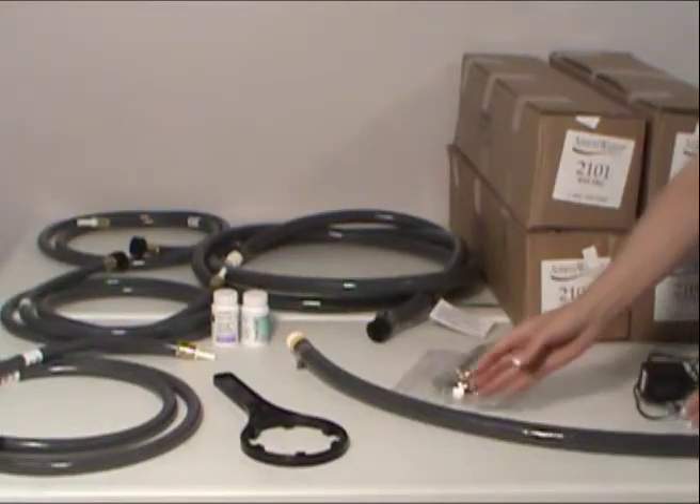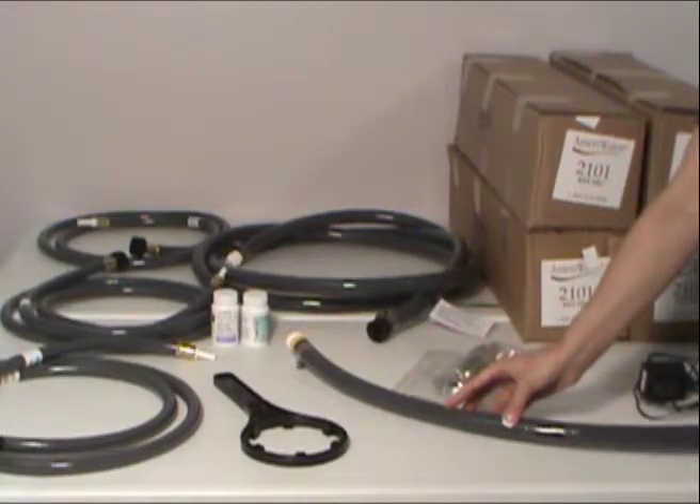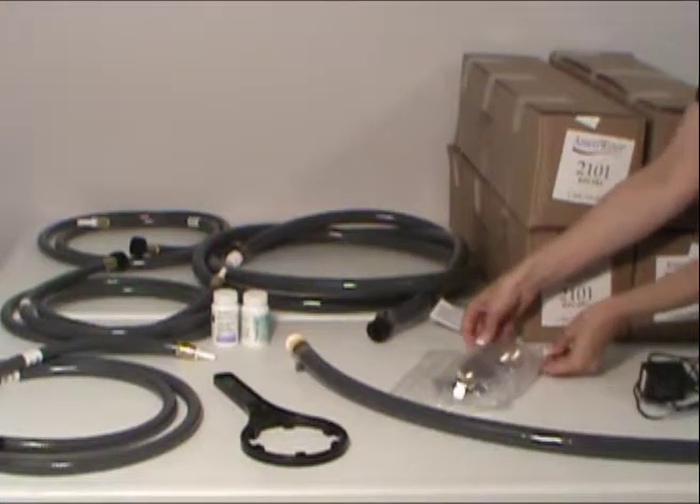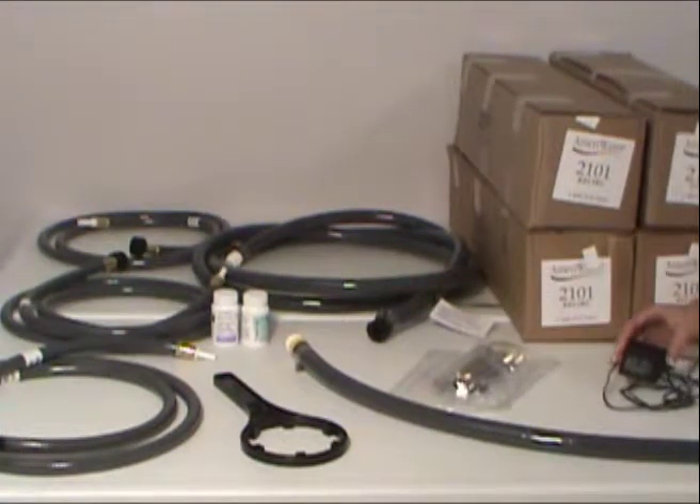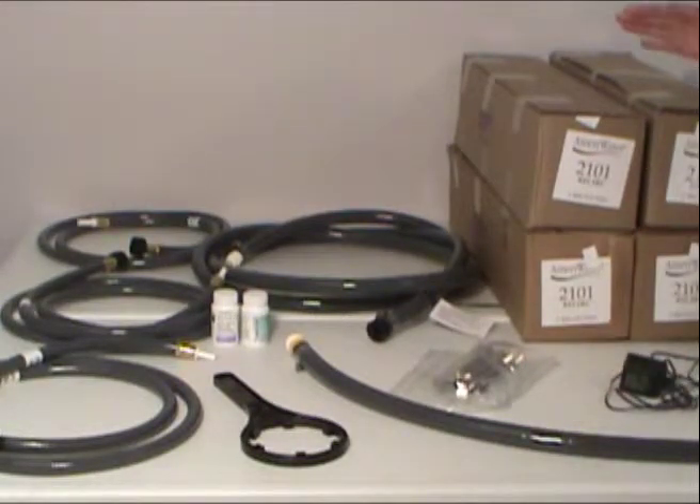Also included are an outlet hose for the storage tank, Hilti anchor bolts for the seismic anchoring of the storage tank, the transformer for the resistivity meter on the deionizer, and the resin packs for the deionizer.